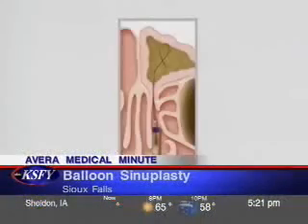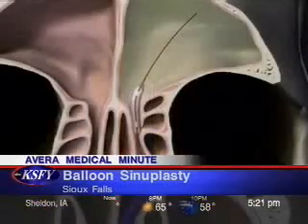What's the outcome been? The outcomes have shown to be very helpful, very good. It's not something that can be used for every sinus operation or in every patient, but it's probably most helpful for opening the frontal sinuses or forehead sinuses that are very narrow and difficult to open without risk of causing scarring that can cause re-obstruction of the drainage pathway.